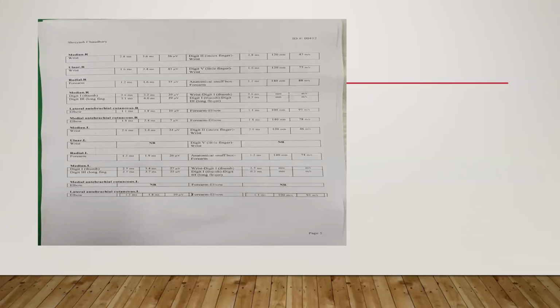How can you say root? The SNAP is absent, so how can we say root? Then, madam, medial cord only. Lower trunk, why not? Yes, ma'am, lower trunk. So it's a postganglionic problem, na? Yes, ma'am, either it is medial cord or it is lower trunk. How will you differentiate between these two?